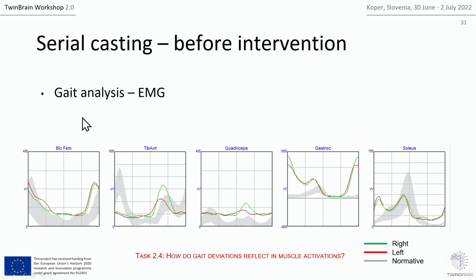So let's now look at the EMGs and what the EMGs tell us, and let's see if this is in line with the story on the previous slides. So let's try to identify the deviations here in the EMGs.